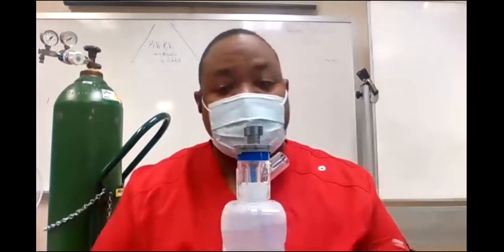All right, so let's look at the aerosol setup. This is the aerosol setup. Now, write this down. Whatever it's called is what you put on the end of it. Whatever you put on the end of it is what it's called. Aerosol, whatever, okay? Whatever you put on the end of the setup is what it's called. That's the name of it. Okay, and I'm going to show you the different things you put on the end.